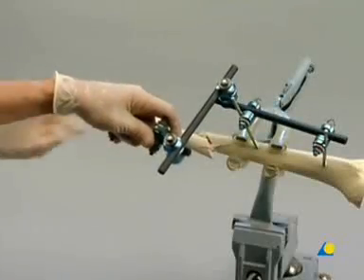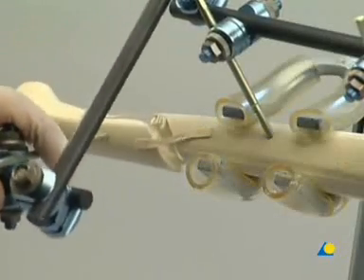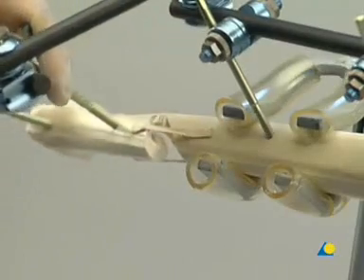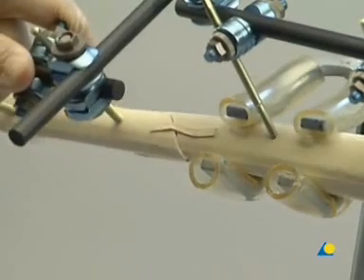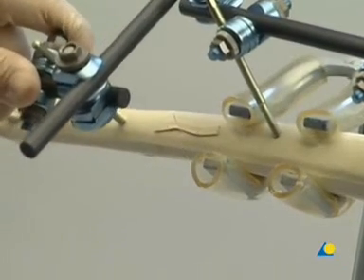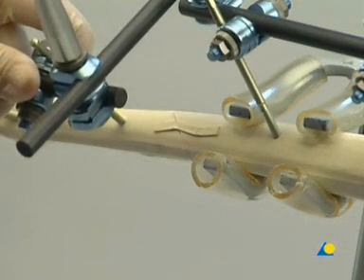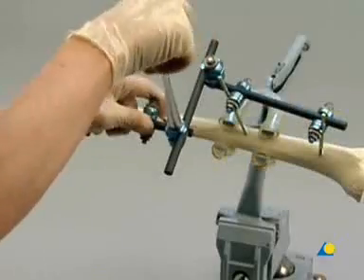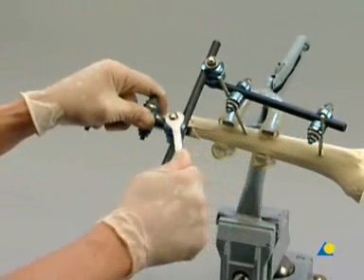The two partial frames are used as handles to reduce the fracture. Clinically, the reduction can be verified by gentle palpation, visually, or with image intensification. The reduction is maintained by hand while the nuts of the combination clamps are tightened alternately. Final tightening is done with the combination wrench.